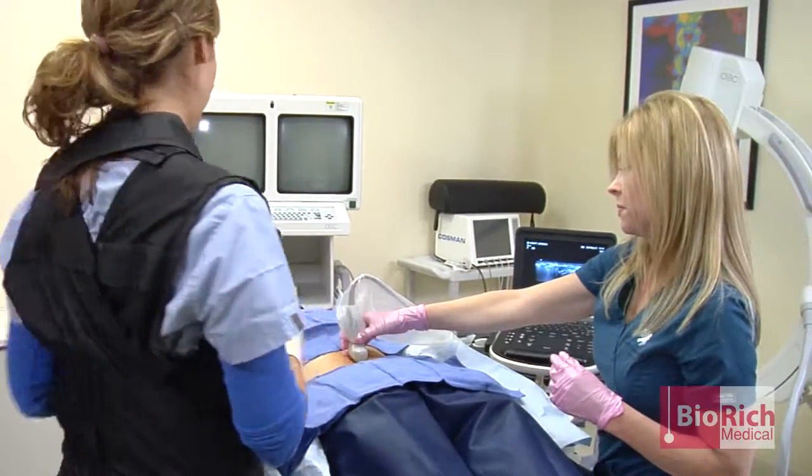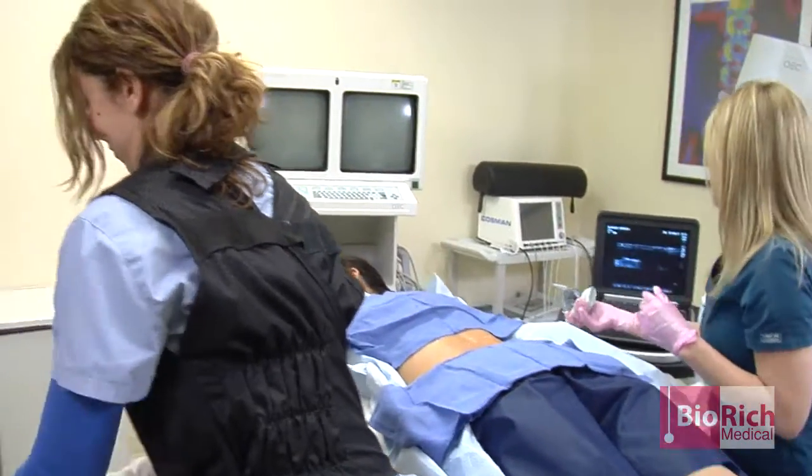And we are done — you did great. So that concludes the procedure. We just completed bilateral L3-4 and L4-5 intrafacet capsule with PRP and ProPlast, as well as L3 through L5 supraspinous and interspinous ligament with PRP and ProPlast, and L3-4, L4-5 half-in half-out transforaminals with PRP.